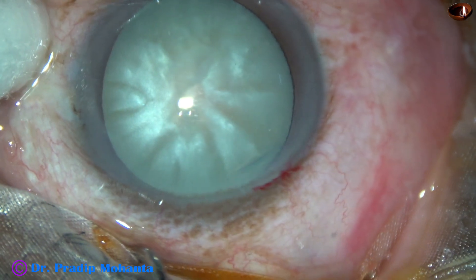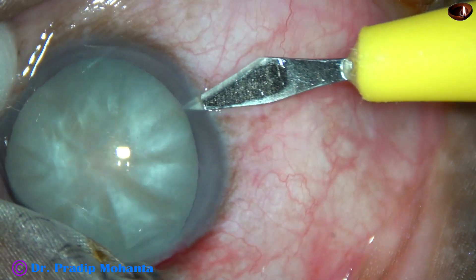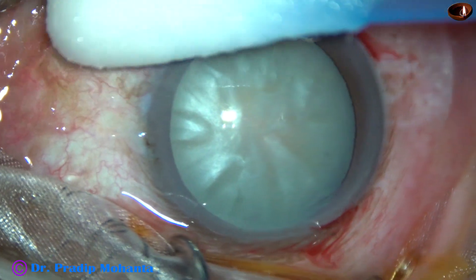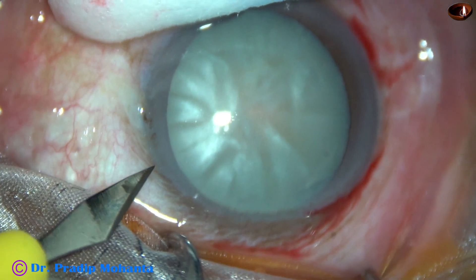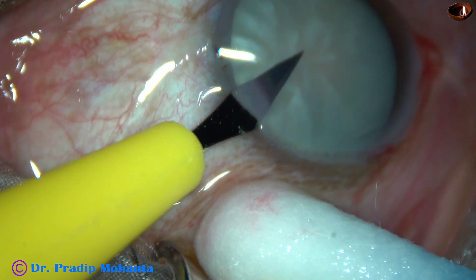This is the main incision. This is a side port on the right side of the main incision, 3 o'clock hours away. And this is another side port on the left side of the main incision, about the same distance away.